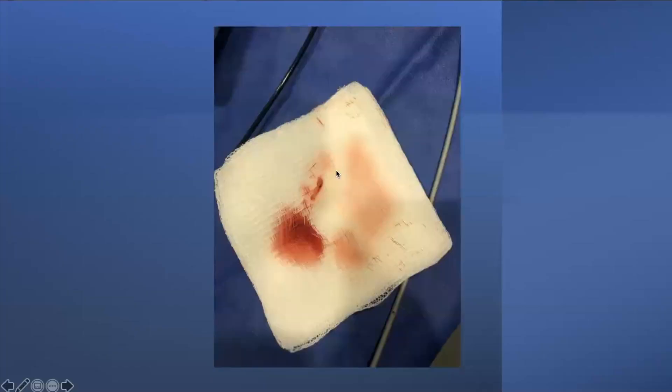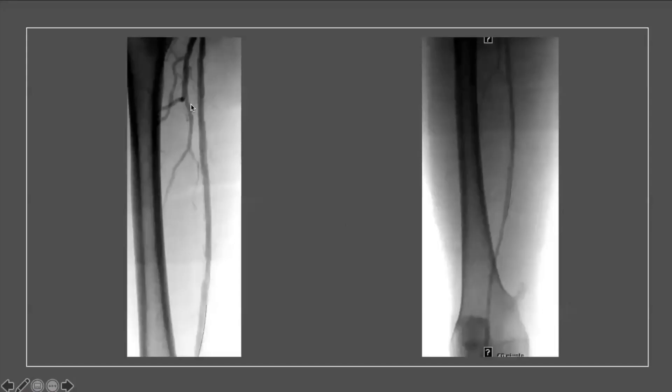Using the Lightning device takes out less blood while helping you aspirate with confidence — you're not just sucking up blood at a high rate. There's also a separator to help pull clot in. You can see the plaque material that came out — there was more clot as well. After aspiration and angioplasty, on the table I did not have to cross the entire area — it was just a focal segment with disease. After optimizing, I'll often use laser because if there's thrombus I feel better pulverizing it with the excimer. Runoff was preserved and looked good.